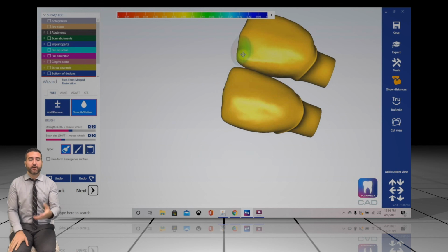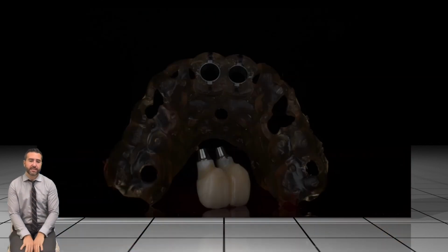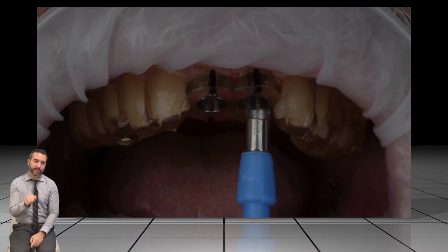And so here we are now. We went ahead and milled the prosthetics. We put our tie bases in. We have our surgical guide 3D printed. And now on the day of surgery, zero stress. So what I do in the day of surgery for this particular case, I mark the lingual aspect of the implant by modifying a punch.